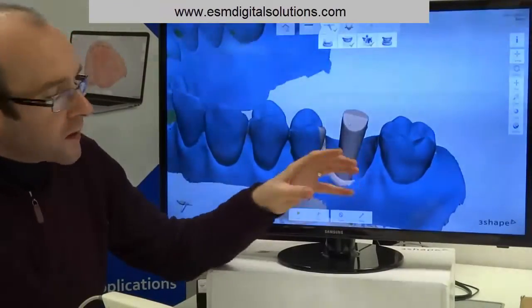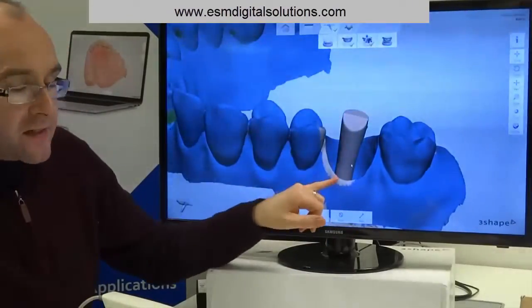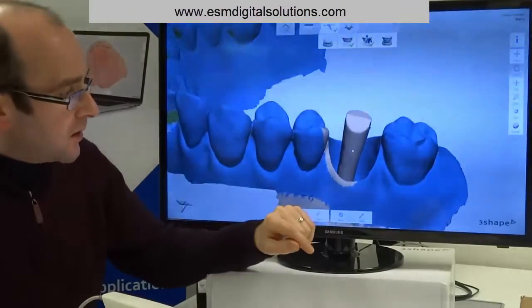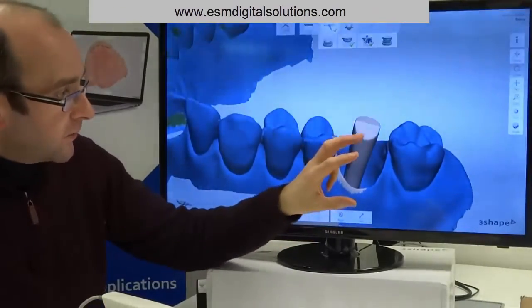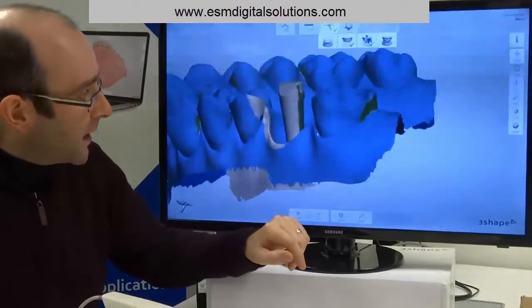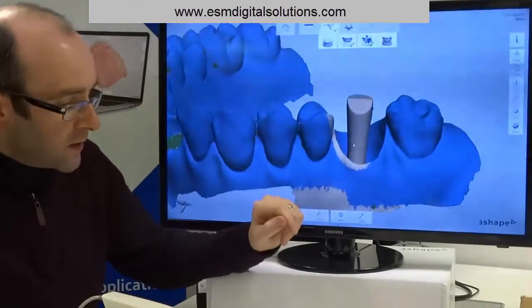When we consider what's happening on the lab end, the lab software is going to take a CAD model of this exact same scan flag and attempt to align it within the CAD software, to align the CAD model for the scan flag with this scan information. So realistically, we have everything we need there. Even though there is some detail missing, we'd be more than happy to proceed with that.